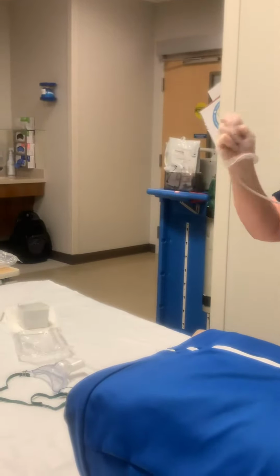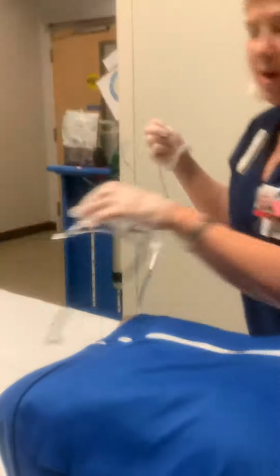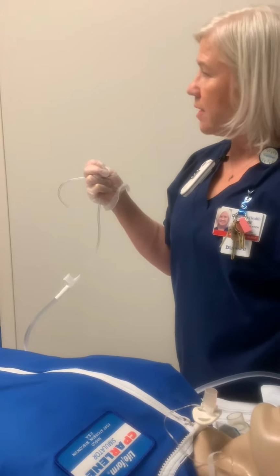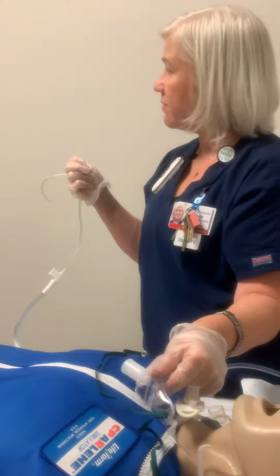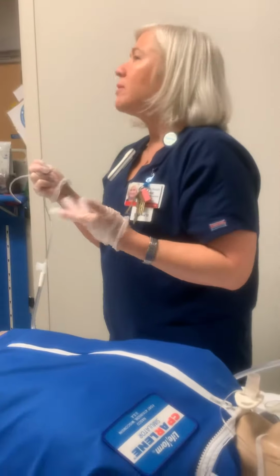So then, if I have a patient who's on a trach collar, which obviously y'all don't use here, I can ambu them, give them 100% oxygen, okay? Or if they have a little trach collar with some oxygen, I'll just leave it on them to give them a few O's. But when I talked to a patient one time, I asked him, tell me what it's like when I suction you.